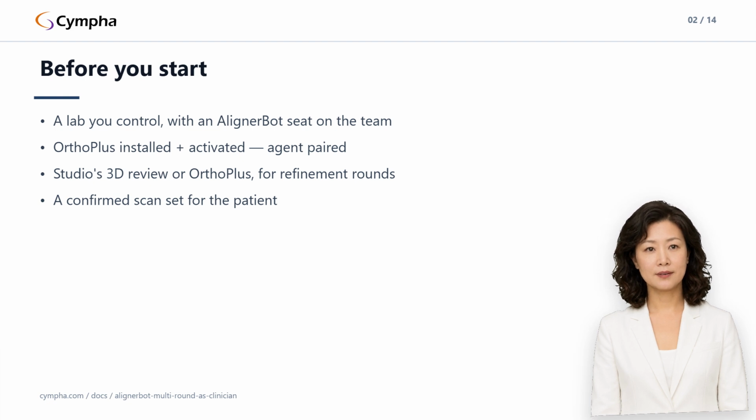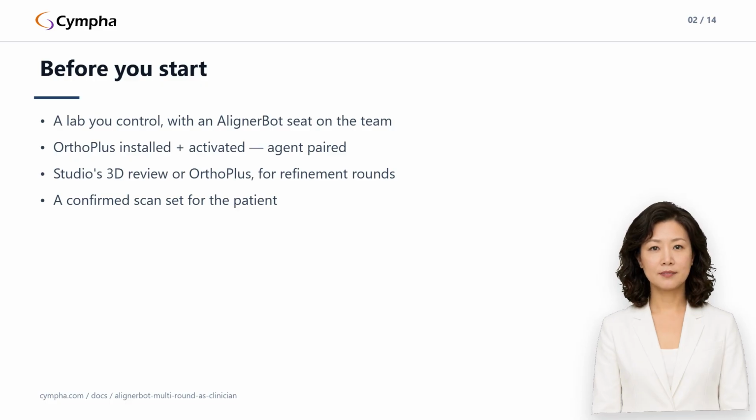3. A way to make refinement artifacts. Either Cympha Studio's 3D Review, which exports an XML tooth position file from the plan and runs in the browser, or Ortho Plus itself, which saves a transfer pack. As a solo operator, you conveniently already have Ortho Plus, so both paths are open to you. 4. A confirmed scan set for the patient.